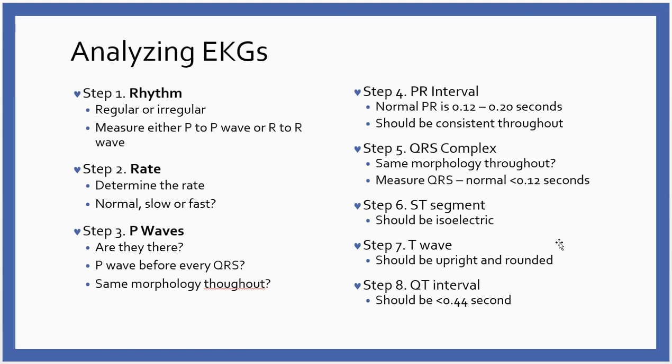But sometimes, even the most experienced of us, people will do wacky things on the monitor and you're not sure what's going on. And especially when you're just learning this, you need a roadway, you need a path. And so that's what this is about. You need an algorithm. And so we need to look at this in a step-by-step manner and figure out what's going on with the patient.